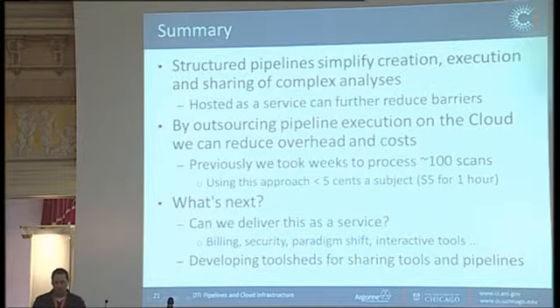Briefly, I think the big point is that structured pipelines can really simplify creation and execution. I think it provides a way that we can structure things and share them and maybe be able to build upon them and transfer knowledge a little bit more easily. By outsourcing to the cloud, we managed to bring our analysis time down from weeks for our 100 scan subject to less than $5 for an hour, so 5 cents a subject.